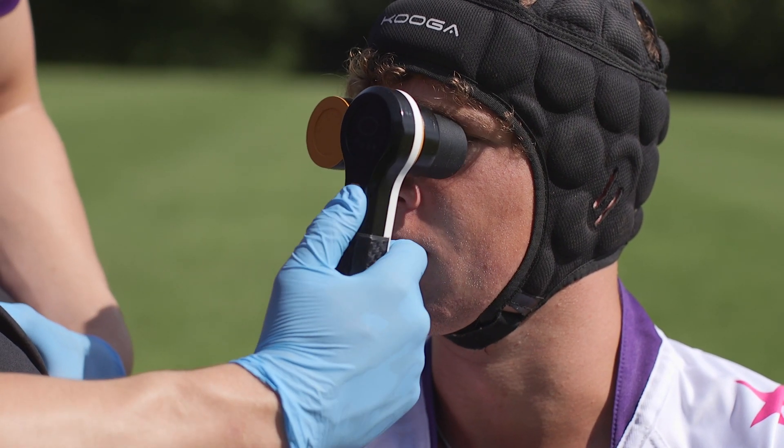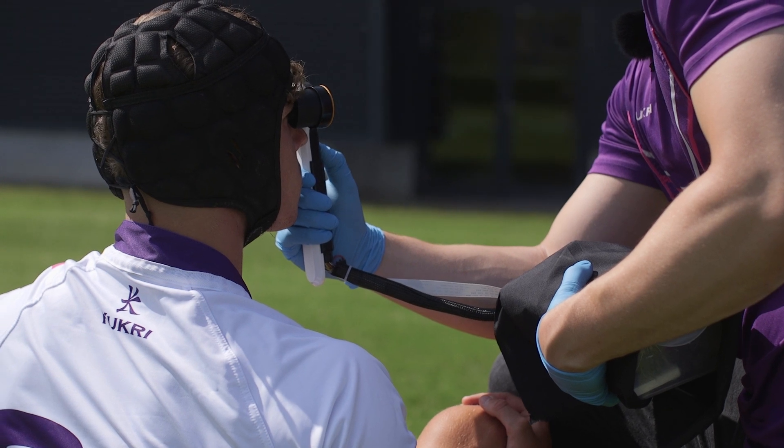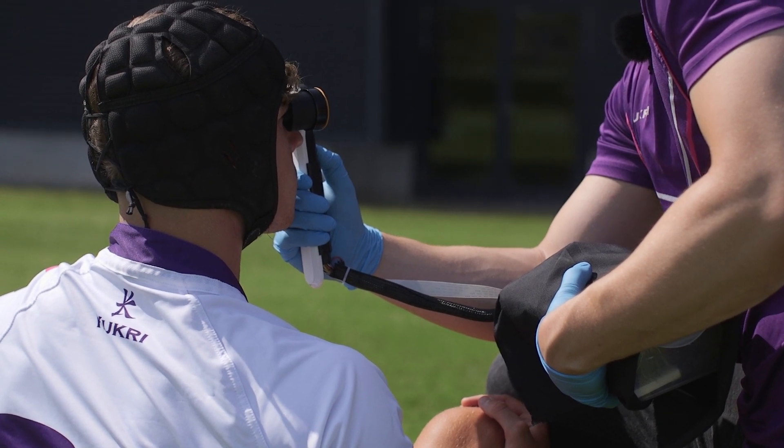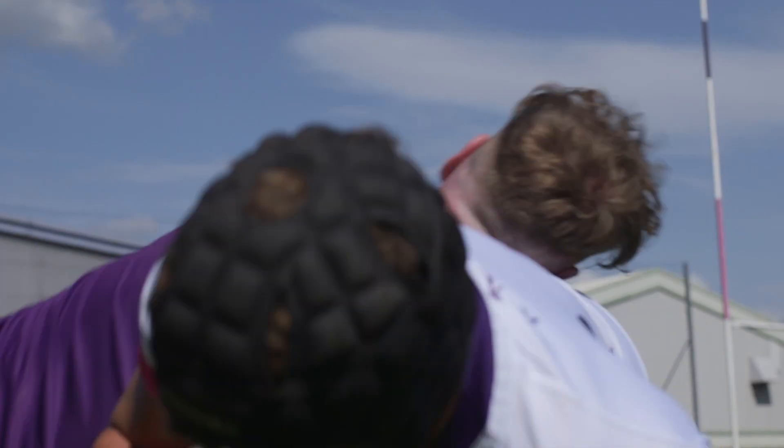Contact is a handheld device used to detect sports-related concussions on and off the rugby field. If you don't detect concussions early, they can lead to serious brain diseases such as CTE, Alzheimer's, and dementia, and this is what we want to avoid.